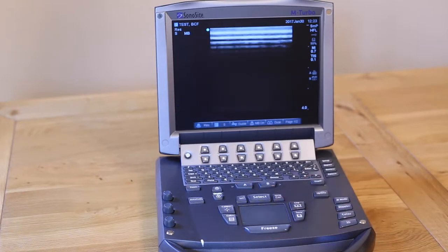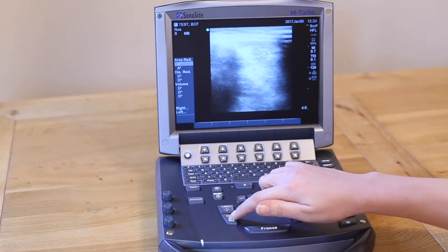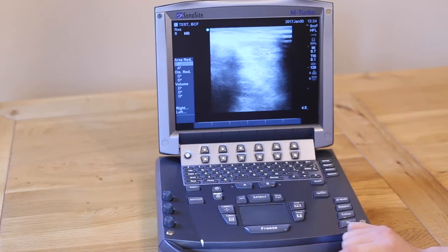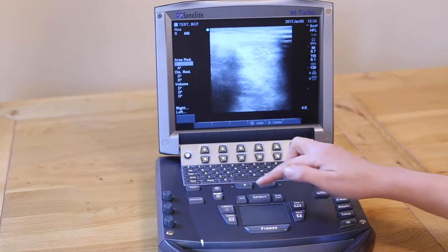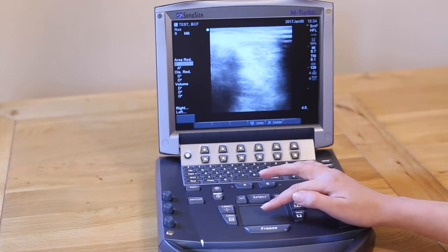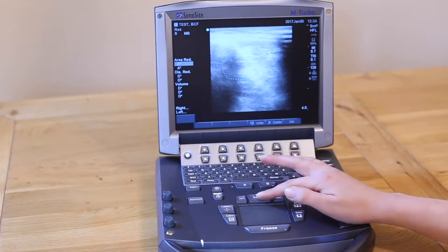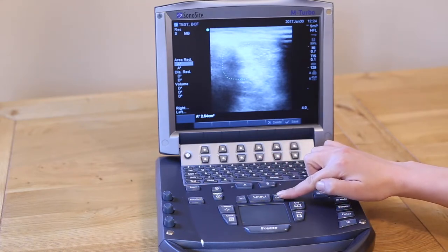Remember to save any measurements on your image before unfreezing if you would like to keep them. If you press Calcs when your screen is frozen, you can calculate the percentage difference between the area of two shapes or between the distance of two lines. Press Calcs, then use the Select button to choose Area 1. Press Select to place your first caliper. Then trace around your tendon and press Select again to place your second caliper. Next, press Save Calc, which is located to the right of the Select button.